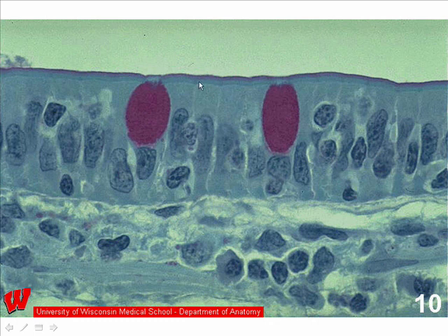And at the top, at the apex, we have specializations that are called microvilli. These are structures that are too small to be seen with conventional light micrographs, but their presence can be detected by this thin blue line, which is actually the terminal web, which we talked about in the epithelial lectures. And this terminal web is the insertion site for actin filaments, which then go up into the microvilli on the apical surface. And this increase in surface area is a functional adaptation to what the cell is here for, that is absorbing nutrients from the lumen.